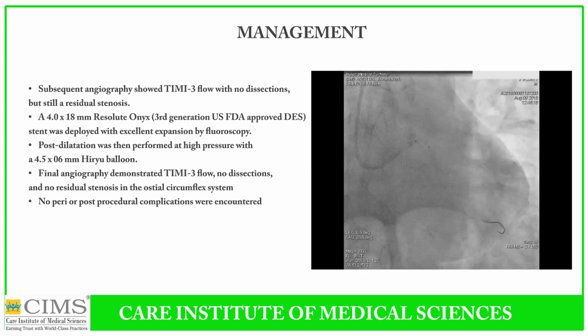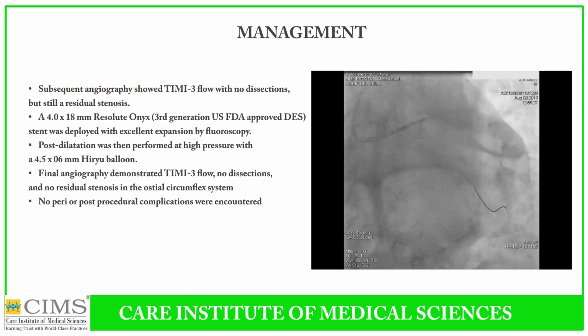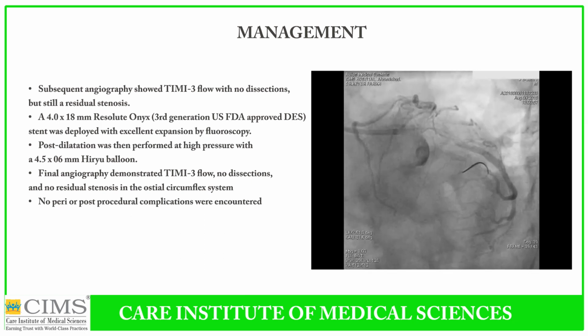A specialized guide liner catheter was used to ease the delivery of the stent across the calcific angle in the circumflex artery. The guide liner or Guidezilla catheters are mother-and-child catheters, where there is a catheter in a catheter, which has been used here, as you can see, and ease of delivery of the stent across the circumflex lesion has been achieved. The stent has been adequately expanded now, and post stent you can see a widely open circumflex artery.